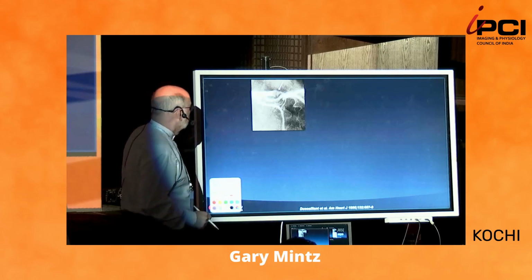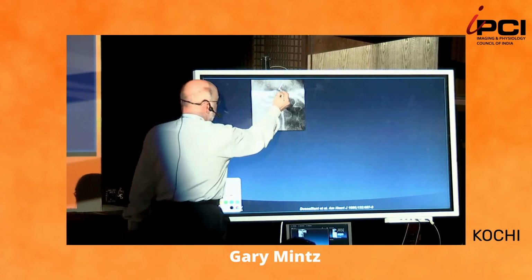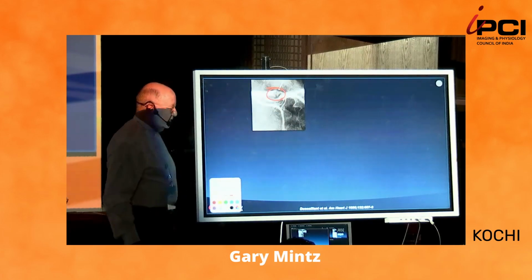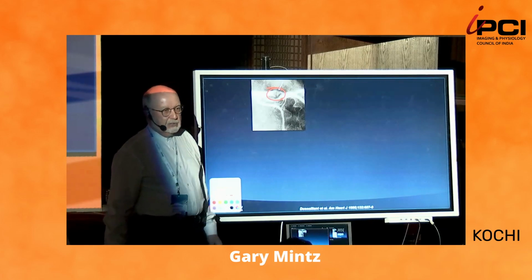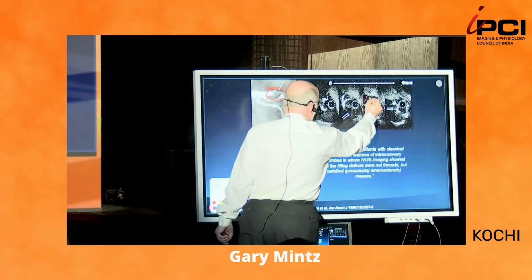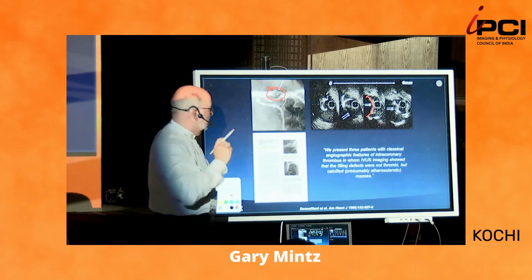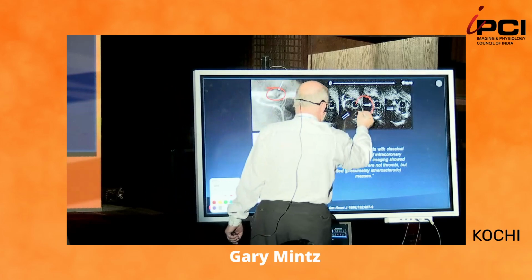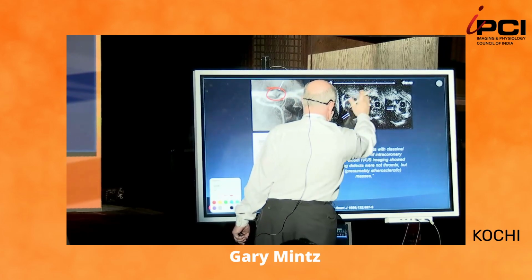And so this is the first reported case of a calcified nodule before the pathologists even knew what these were. This is an elderly woman who presented with acute coronary syndrome with this in her LAD. It was on a Friday. We put her on anticoagulation over the weekend and brought her back, and it hadn't changed. And we did IVUS imaging, and you can see this, a calcified nodule. Remember, ultrasound doesn't penetrate calcium. So this nodule is probably this, but you only see the leading edge, okay?